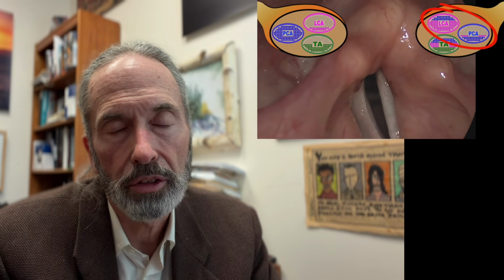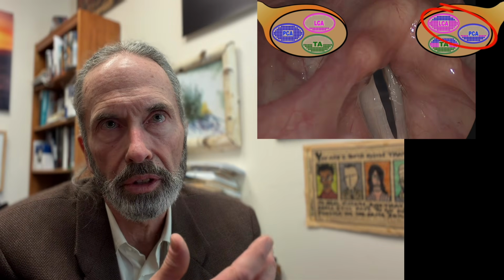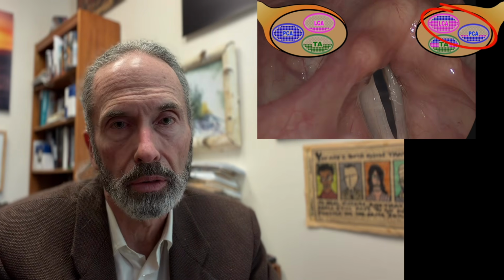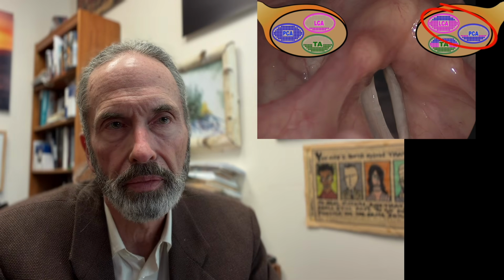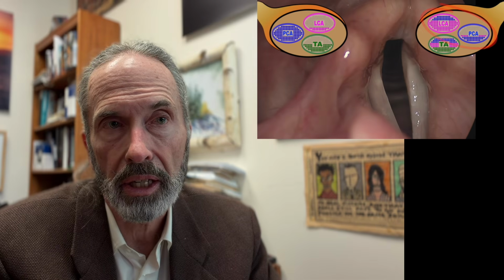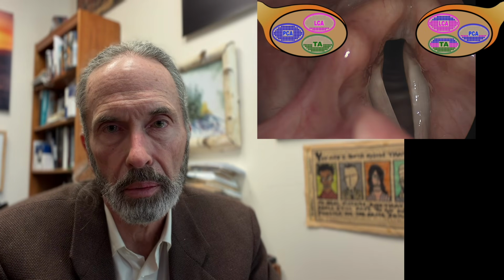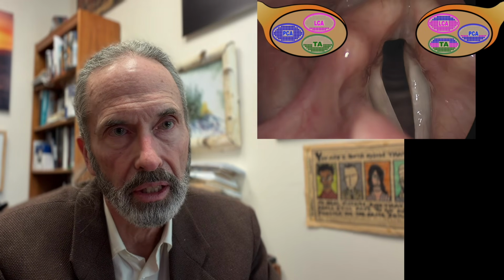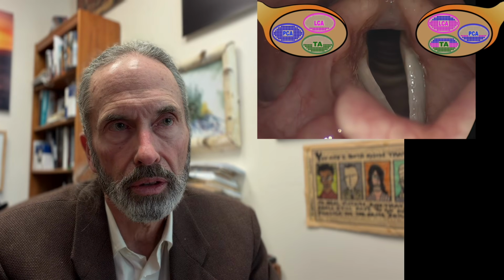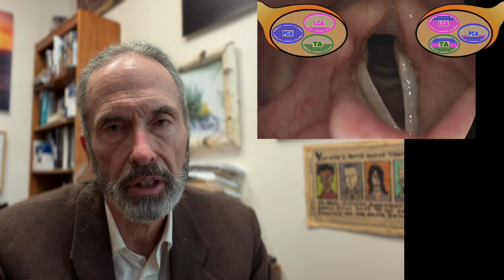So I think the injury on the left side is an old injury. It has reinnervation, impairing the overall range of motion, but it's actually quite strong during phonation. And the right side has probably the more recent injury, which is just a weakness. So matching it up with their complaint, that's the current injury.